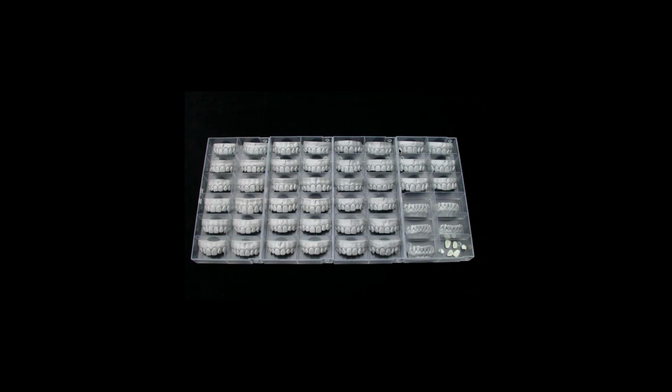Every time I do a diagnostic wax-up, I take my wax-up model and this model, and I like to copy some of them.